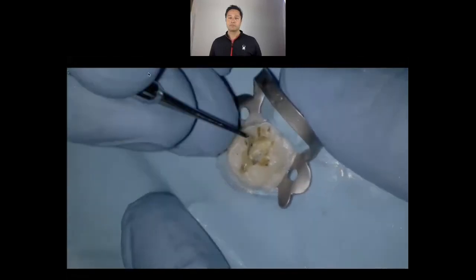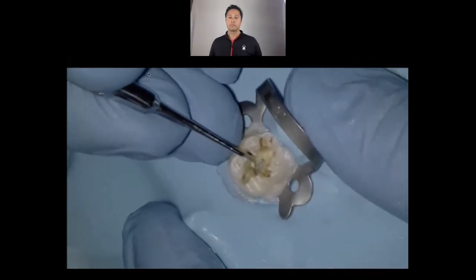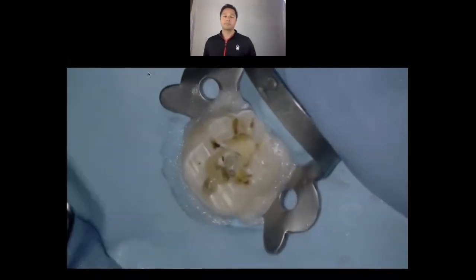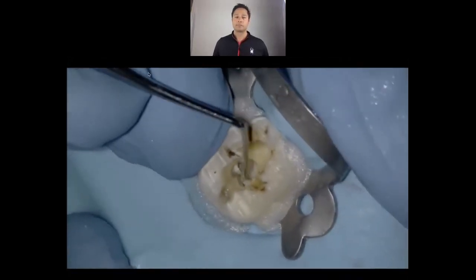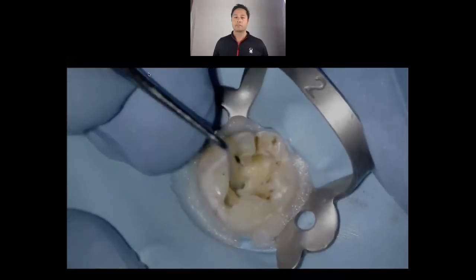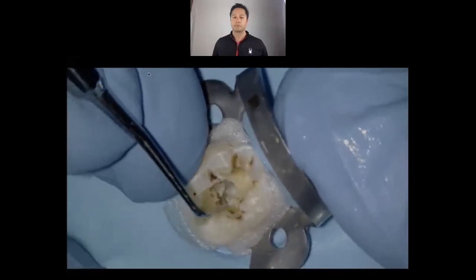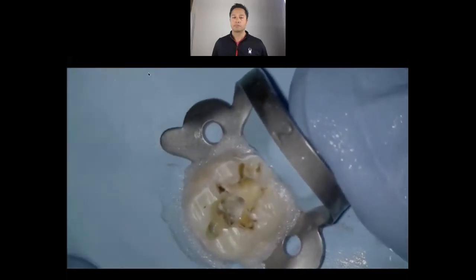So leveling off two millimeters right off the get-go allows you easier access to the orifices and honestly keeps the patient from biting down, since we might not be seeing them for a long period of time. Now we've gone into the pulp chamber. Because this is necrotic, this would need a pulpectomy to remove all the necrotic material. I'm just trying to flick any pulp tissue and see if there are any stones I can get out, because the last thing you want is to get stones lodged down a canal.